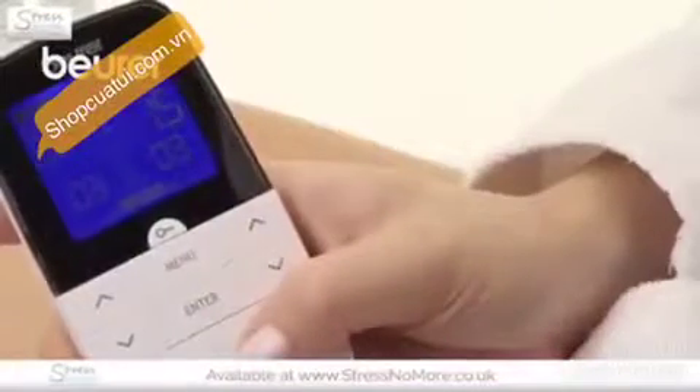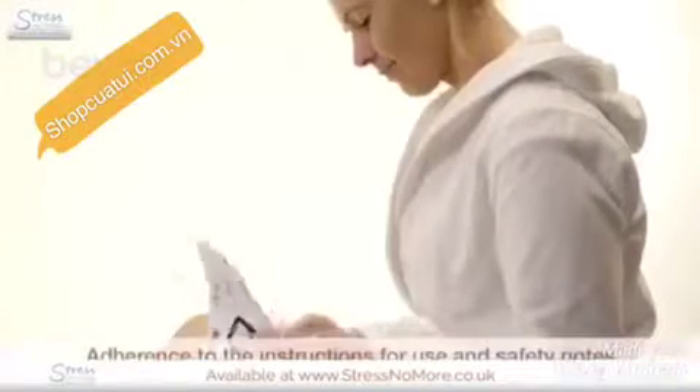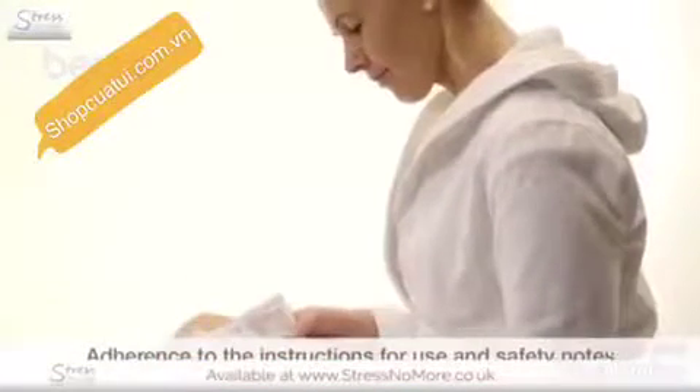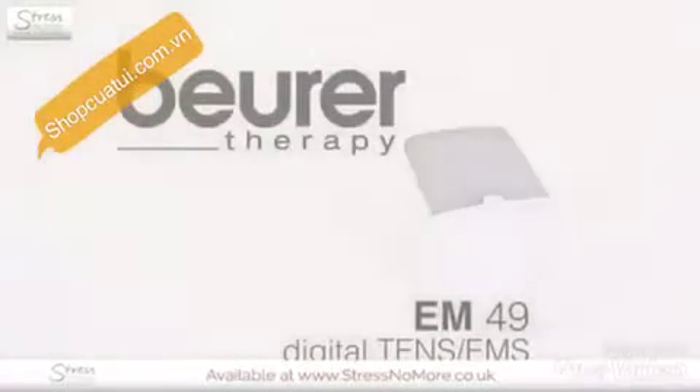Switch off the device after the program is complete. Observe the instructions for use and safety notes. We hope you enjoy using the EM-49 from Beurer. Stay healthy.